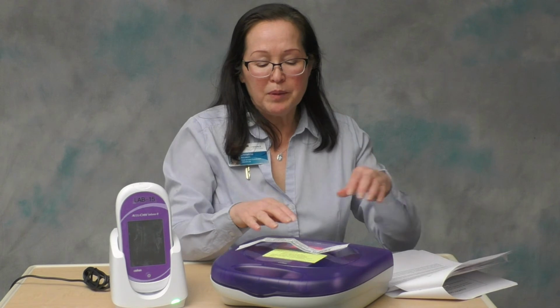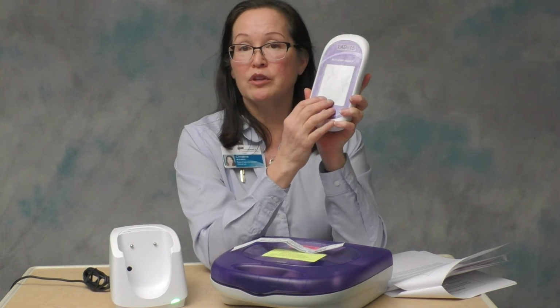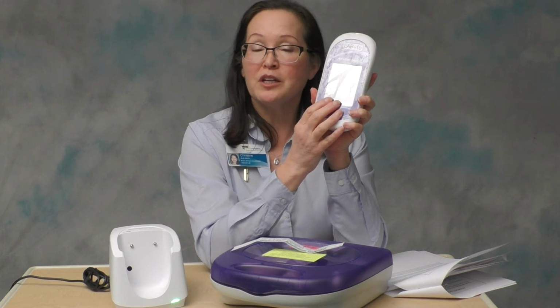When you scan the patient's armband, we have a safety feature with the meter. A pop-up display will appear on the screen that will show the patient's name and date of birth. This is a stop check for you as a nurse to ensure that you are performing the test on the correct patient. If this is not the patient that you're performing the test on, hit the red X and go back out and get the correct ID.